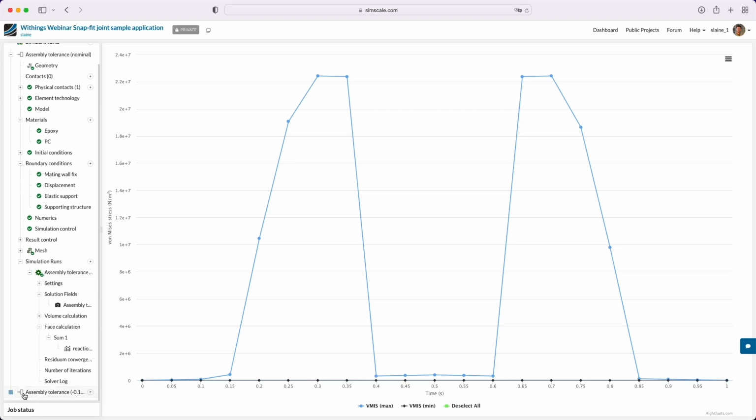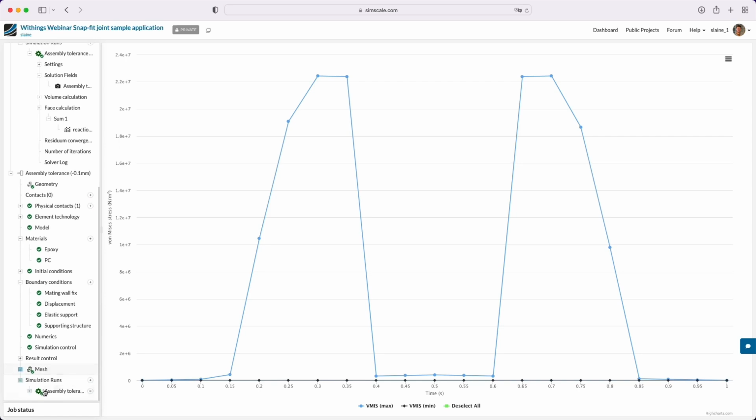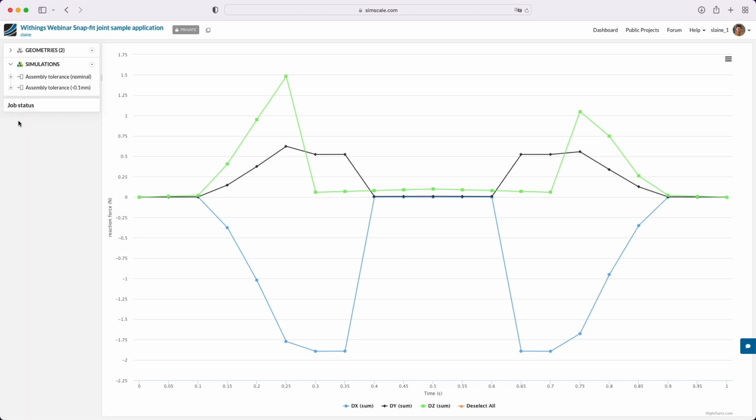So if we compare that to the minimal tolerance, so it was 1.2 newtons for the assembly of the nominal tolerance, but for the minimal tolerance we've got a slightly higher, almost 2 newton force for snapping the part together and extracting the snap as well. So again, very useful to be able to see these side by side. So how did we actually get here? Well, I'll take you through how we set up this simulation.